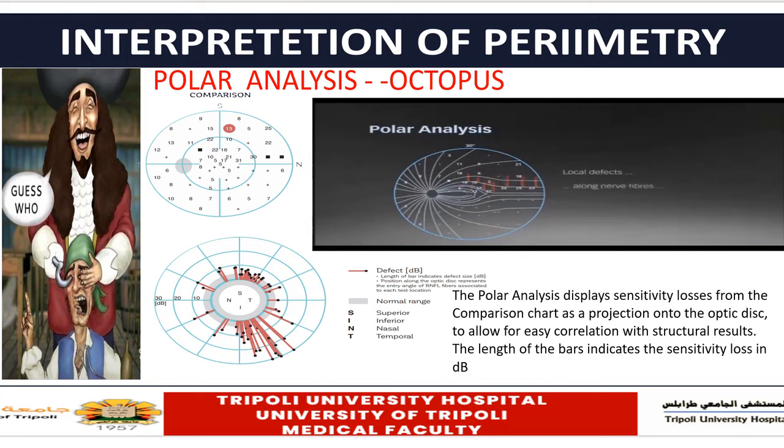The functional changes in the visual field are tracked back and reflected to the optic nerve, and according to the Garway-Heath postulation for the distribution of the nerves on the optic disc, we can transpose or invert the image.